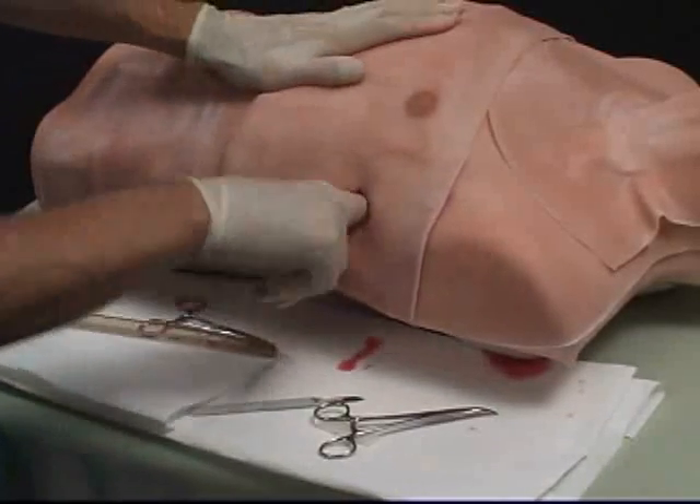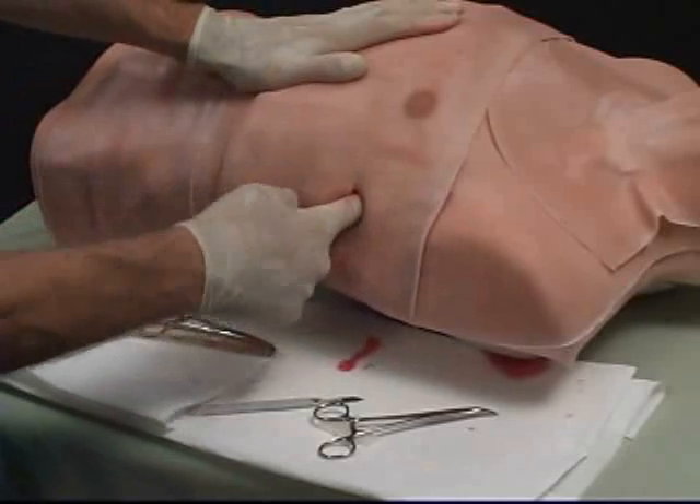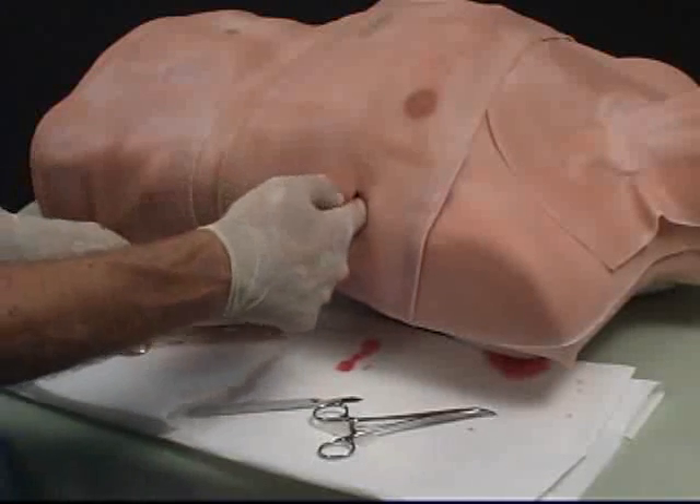When a finger is inserted into the cavity, the inflation and deflation of the delicate lung tissue can be felt.